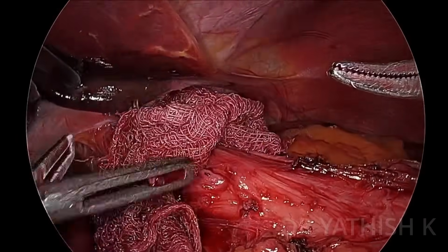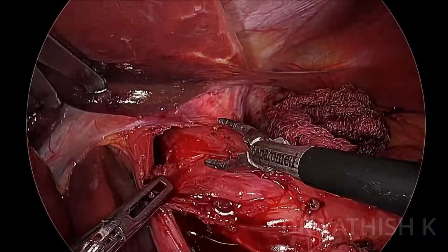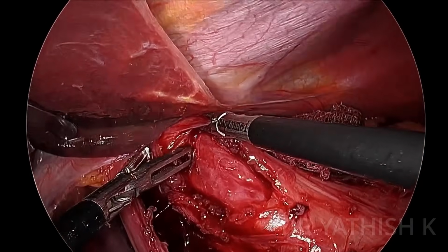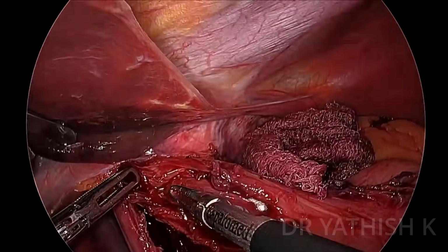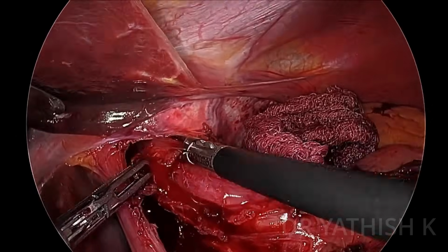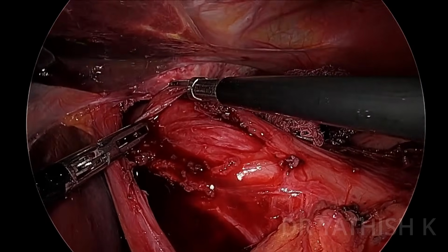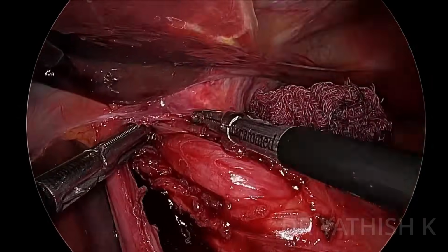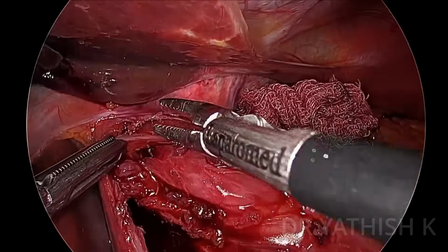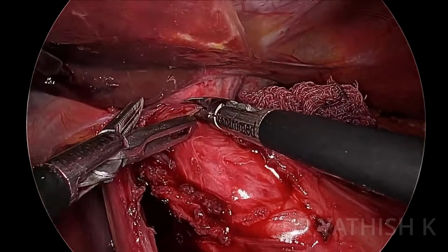You can see the mucosa is popping out, so there's a clear difference you can observe. Your mucosa is popping out when you separate those muscle fibers. One more tip: when you cut any muscle fiber, there will be some bleeding. You don't have to panic when you bleed. If it bleeds, just use good gauze compression. That's more than enough. And make sure you don't use any energy device.